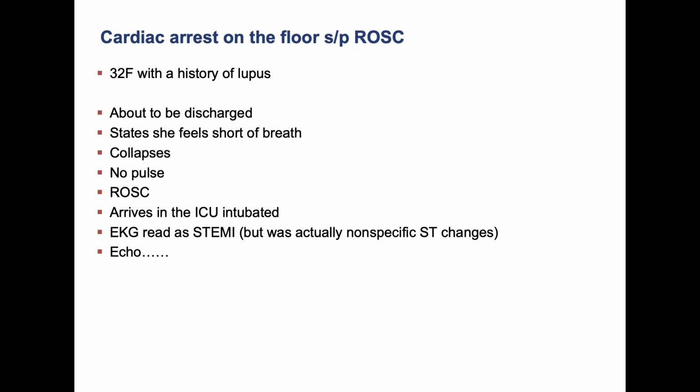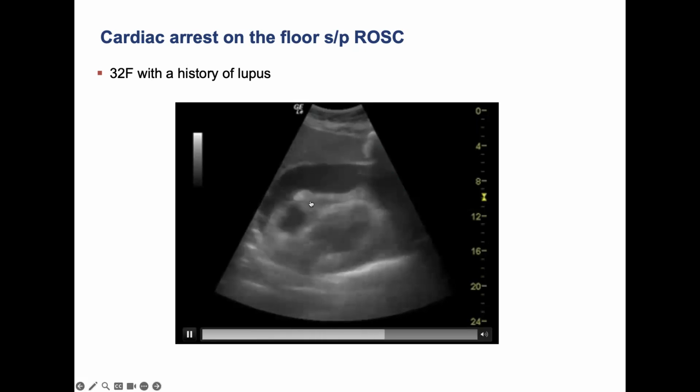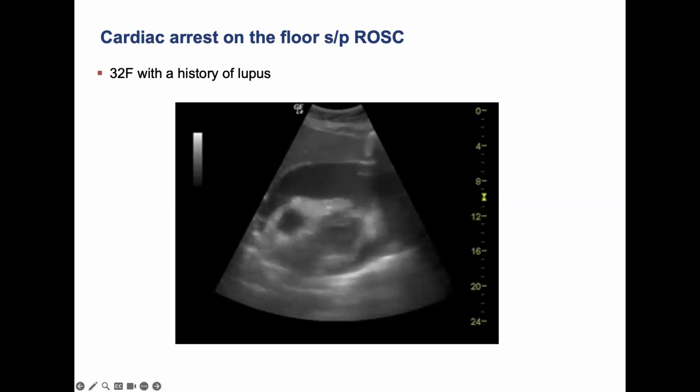And so the first step, of course, is to grab my trusty ultrasound, my echo, and do an echo. And this was not her exact ultrasound, but this is essentially what I saw. So this is a subcostal 4-chamber view, although I have trouble calling it a 4 because you can barely see this little chamber right here, but this is tamponade. So here's your liver, here's your large effusion, LV, LA, RA, and here's your RV that is trying to fill, but is not.